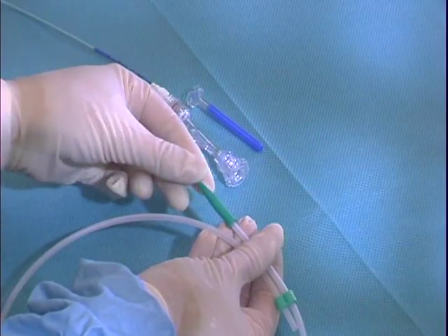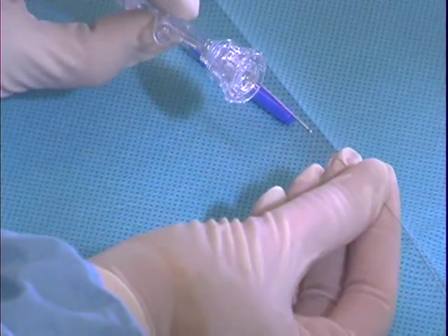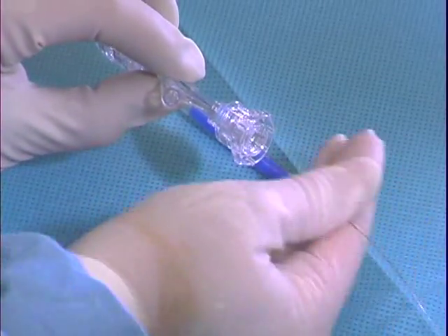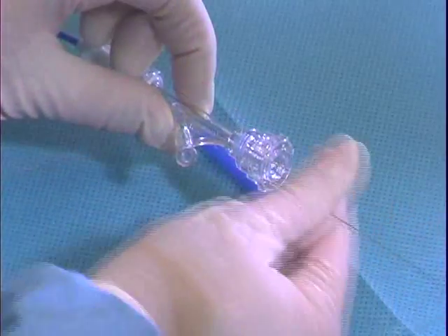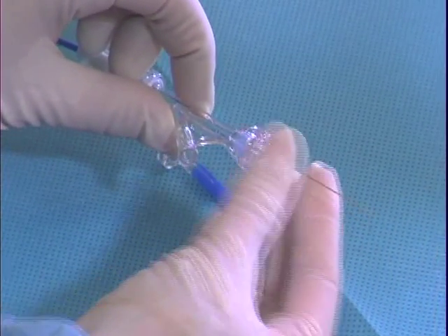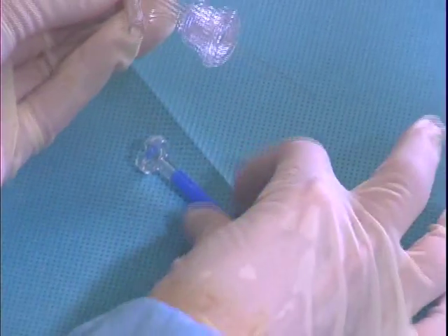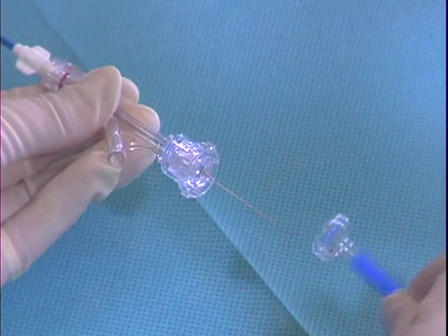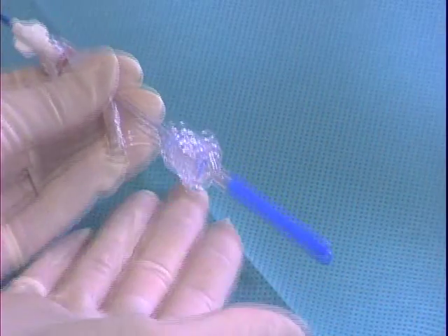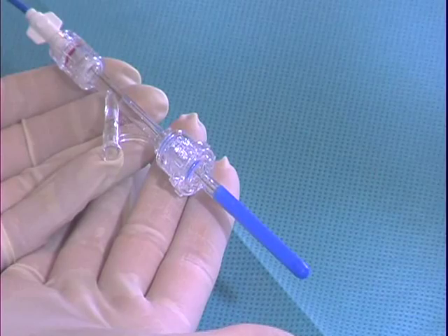With the 5 French Fountain system, advance the occluding wire until it stops and does not advance any further into the catheter. This ensures that the wire is correctly placed within the Fountain catheter tip. Close the hemostasis valve by rotating the fitting clockwise until the valve is completely closed. Place the provided blue wire protector cap over the exposed portion of the occluding wire to prevent any potential injury from the exposed wire.